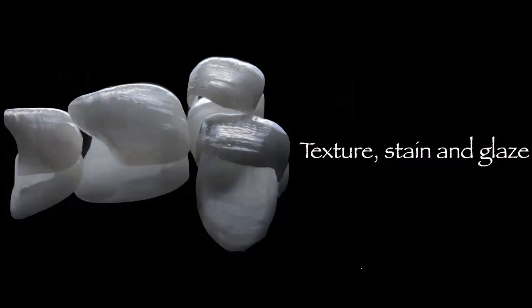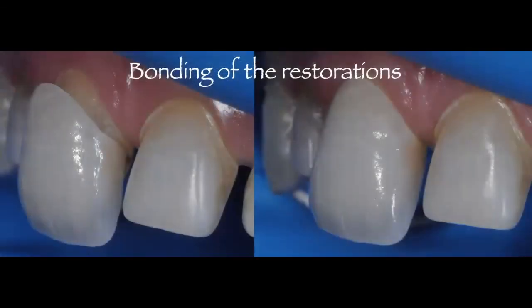Then they have to separate that, and it's a very technique sensitive, very delicate restoration. But before they separate them from the dies and from that foil paper, they get to do all this texturizing of the restoration and glazing of the restoration. But you as a dentist have to be very careful when you handle these restorations as well.